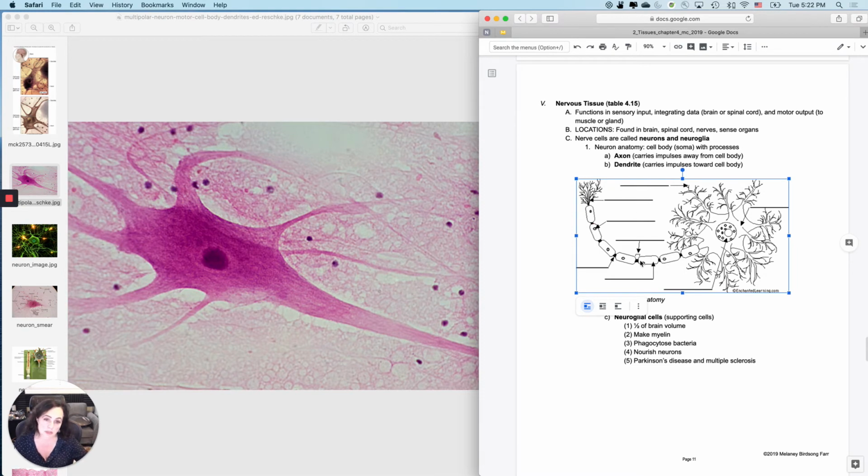There are some other portions that you can see here that are labeled in your textbook. There are portions that are myelinated and portions that aren't. You don't have to label all of them right now, but you can, because you'll have to do it later this semester anyway.